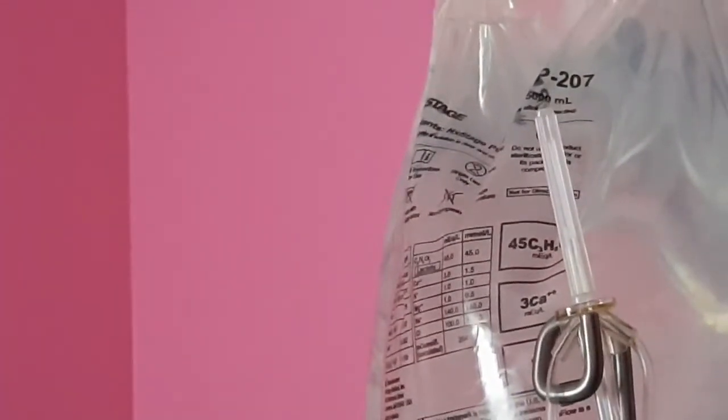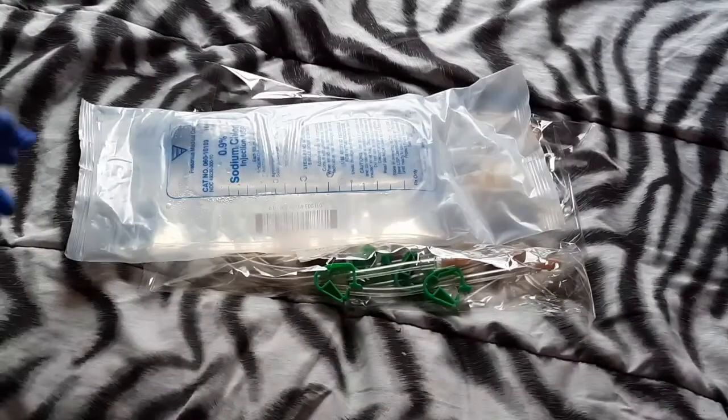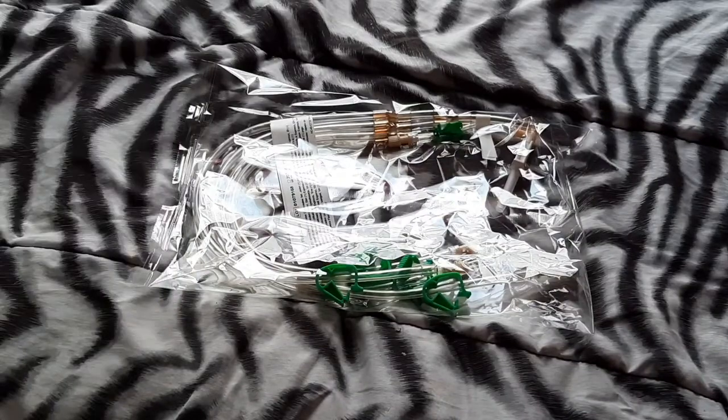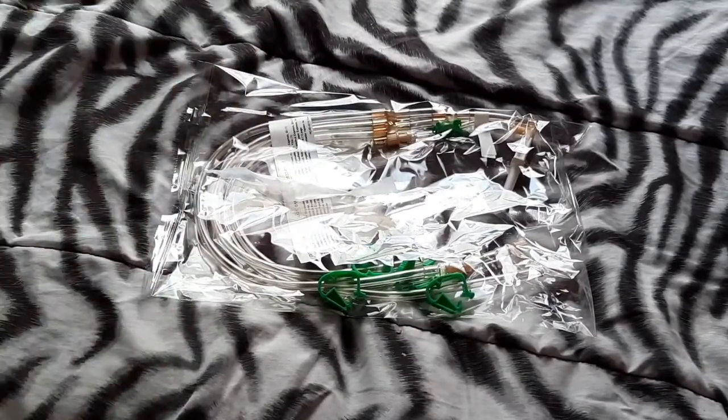So that's sealed. Now we're going to move on to connecting our spike, this right here, to a saline bag. So let me get the saline bag. Okay, so now we have our saline bag, 0.9% sodium chloride, 1,000 milliliters. And like we said, we checked the date on the back already, expires October 21. Alright, so now we're going to tear this bag open, find a little slit, and tear it down. They don't always tear it down for you. So you gotta get in there and tear it.